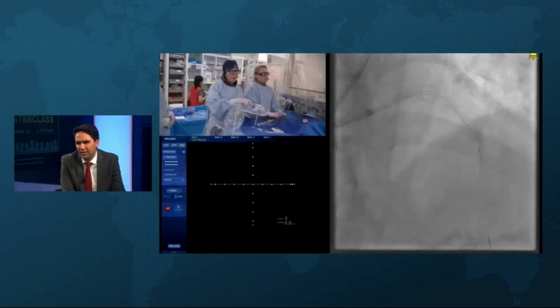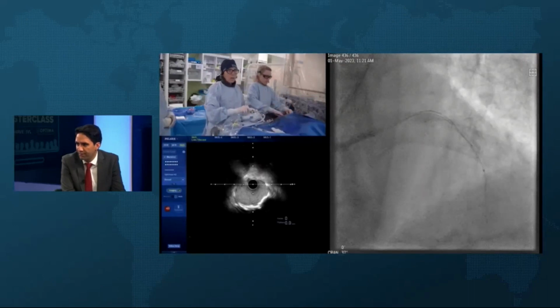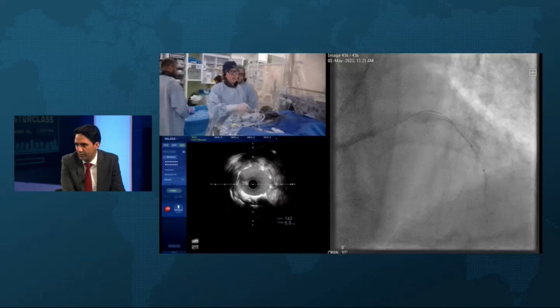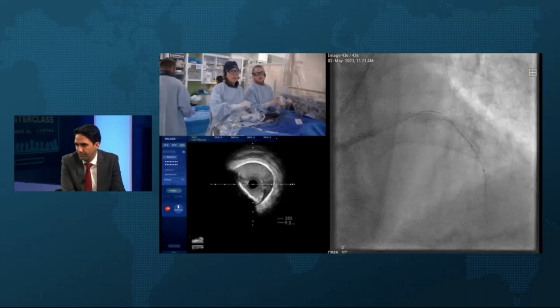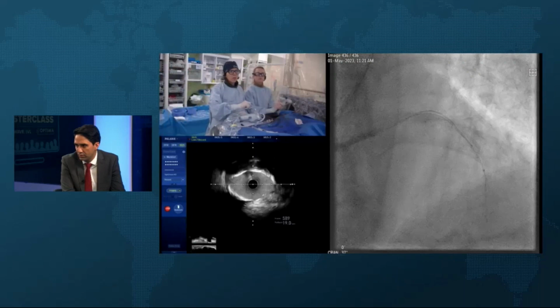Okay, we're going to go from here and get a proximal length measurement. Great. That's us in the front end of the other stent. Let's see. Did you take that up? The front end looks pretty good, 3.5 or okay? Craggy. Split. There's your flap. Nice picture. Lovely. Fractures. That's great. Lovely.